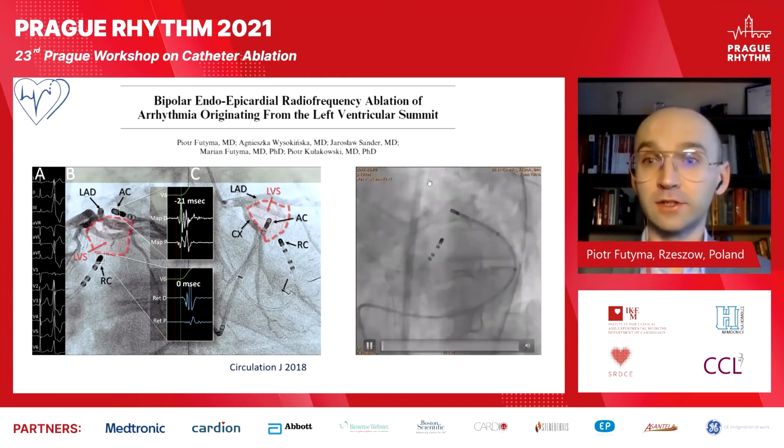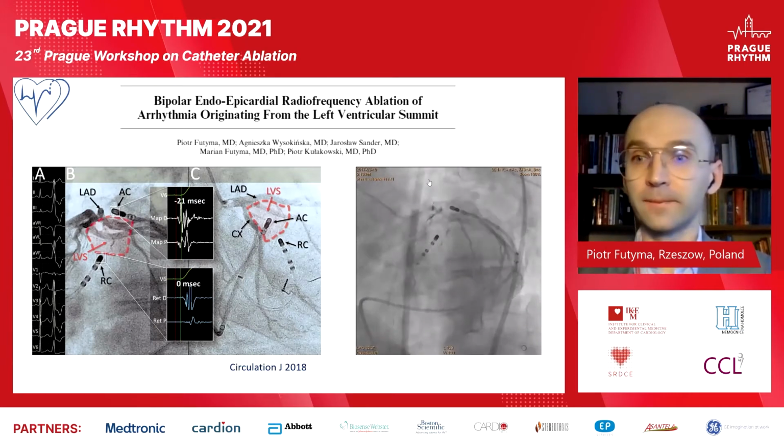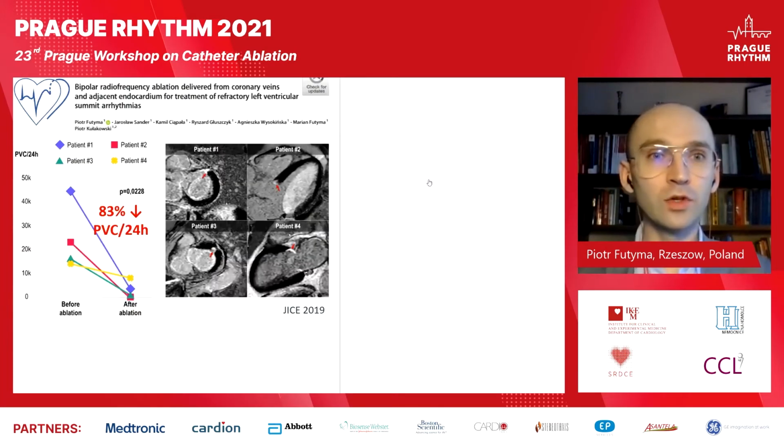Nevertheless, bipolar ablation was ultimately successful in this particular patient. We treated 4 patients so far using this approach. We achieved a significant PVC burden reduction in all study patients and no VT recurrence in 1 patient.